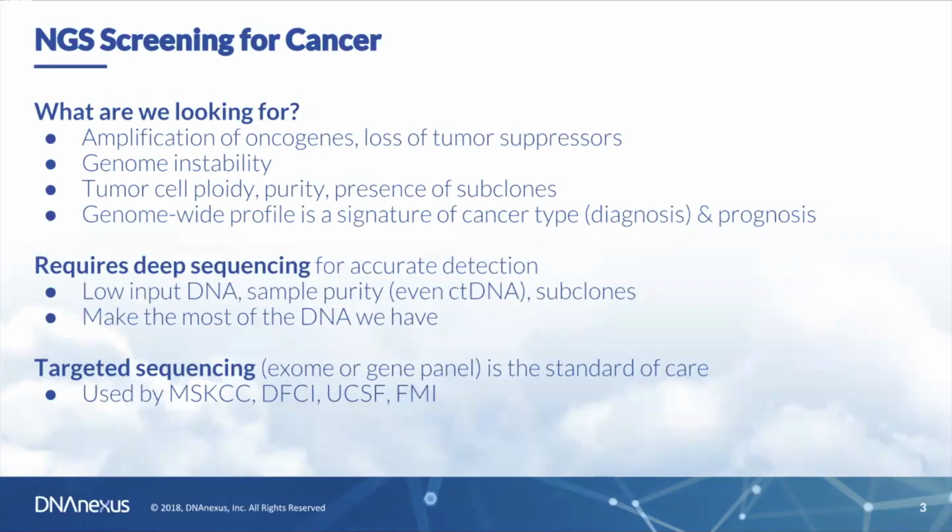All right, first of all, we start with the basic problem, NGS screening for cancer. We're looking for copy number alterations of a variety of different kinds to use for a variety of different signals for tumor diagnostics, prognostics, and copy number analysis can help with all of that.